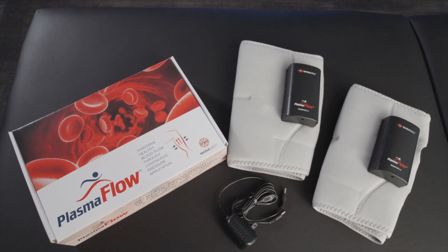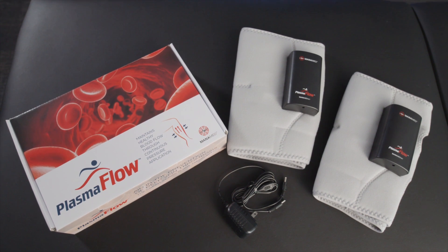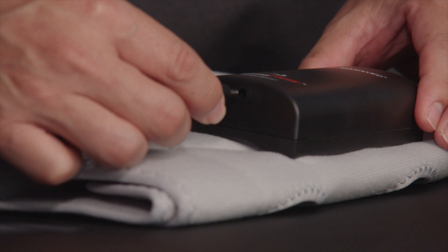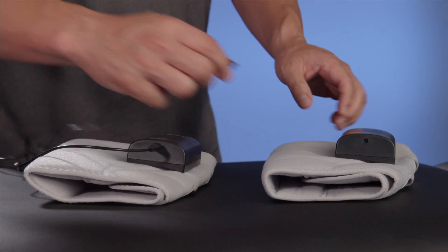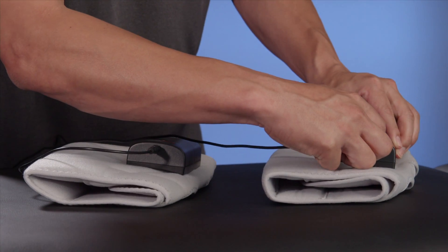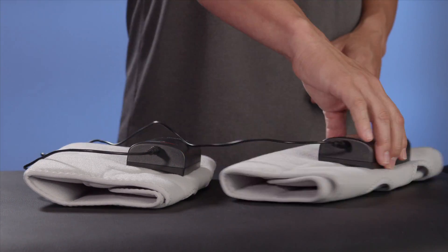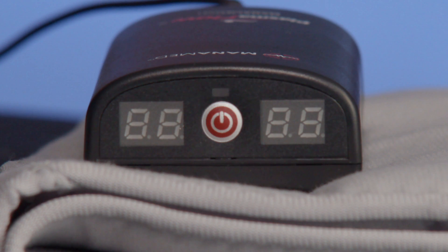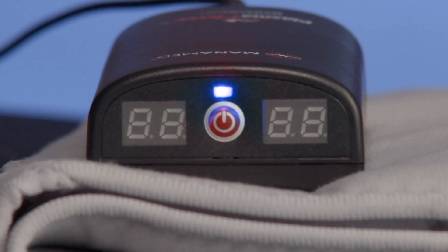The PlasmaFlow consists of two CAF cuffs and a power supply. Out of the box, begin by plugging the power supply into a wall socket, then plug the other end into the charging port of both cuffs. A blinking red light will flash indicating the devices are charging, and the light will change to blue when the devices are completely charged.